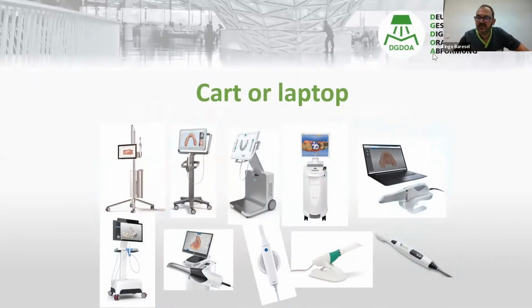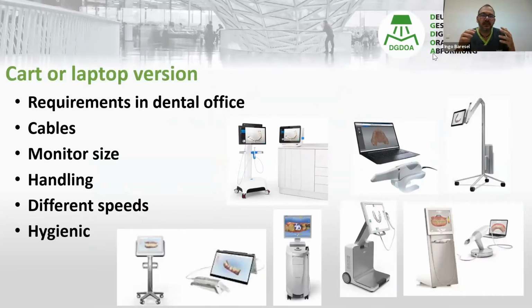Cart or laptop? This is even a question. Some of the scanners you can just buy as a cart version, and some of them you can buy just as a laptop version, and some of them offer both. The requirements of your dental office, of your clinic, are important, because if you have several levels or you have 3 offices and want to travel, then it's easier to have a laptop version. But I don't like laptop versions. Why? Because carts are much easier to use. You just grab them, bring them to the next room, grab it again, bring it to the next room, and you don't have to carry a laptop and whatever.